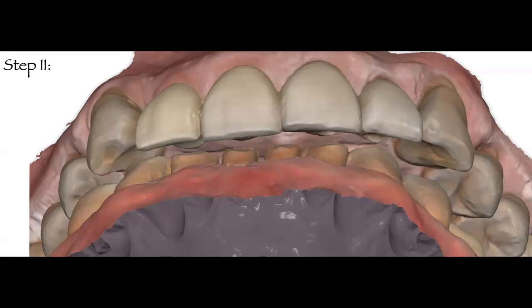And what you are seeing in this scan right now is actually that relationship that I was able to record with my scan, obtaining a left and a right occlusal scan with the leaf gauge interposed in between the maxillary central incisors and the mandibular central incisors. So now you can see that I've created enough space for me to restore without cutting or removing any tooth structure all the way from canine to canine on that mandibular arch.